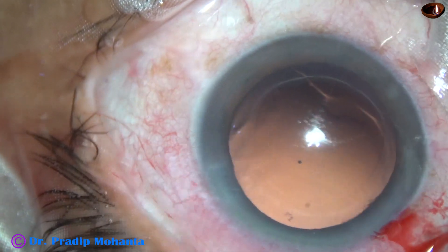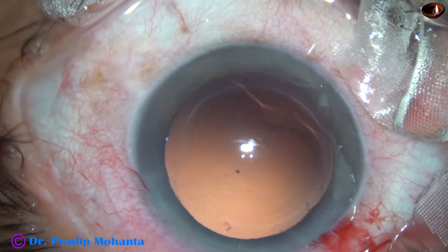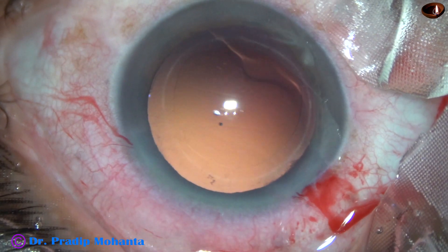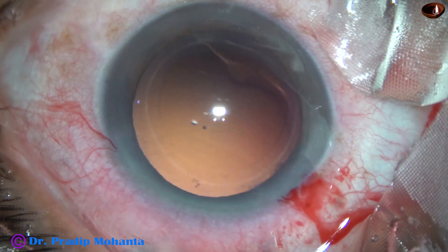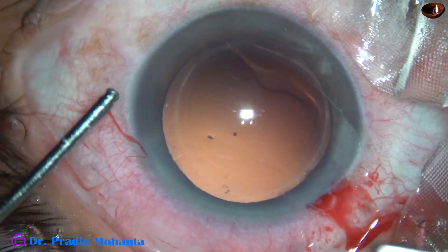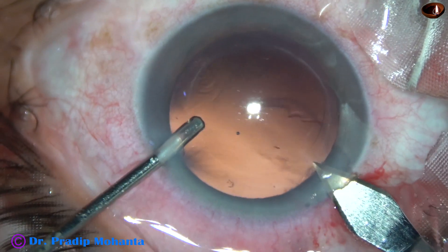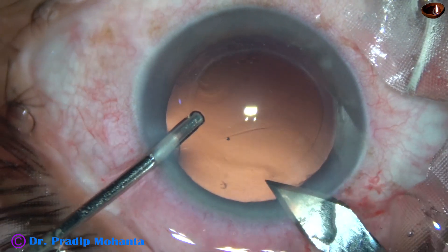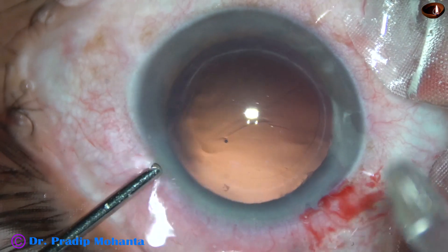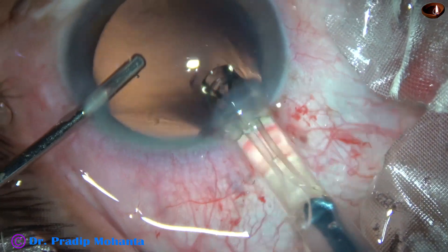The cortex is nicely cleaned. The posterior capsule is clear — there are no cells sticking to the posterior capsule. Now I am going to enlarge the main wound a small bit, because I am going to use a B-cartridge. If I don't do this, implantation of the intraocular lens may be difficult and the lens may get stuck at the wound.